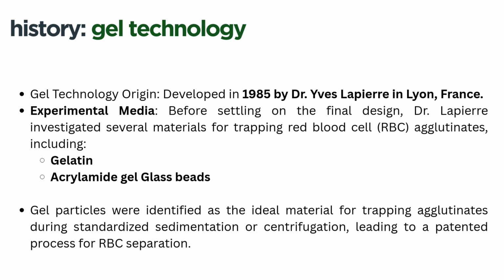So for the history, I don't know how to read his name. It's Dr. Yves Lapierre, a visionary in the field of immunohematology, and he pioneered the development of gel tech in 1985. So his work took place in Lyon, France, and fundamentally reshaped how we approach the separation and analysis of red blood cells.